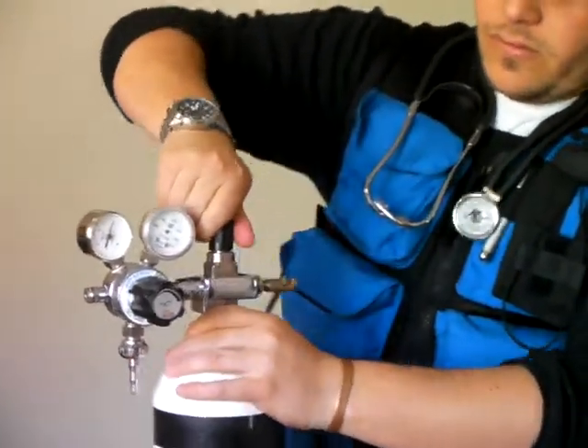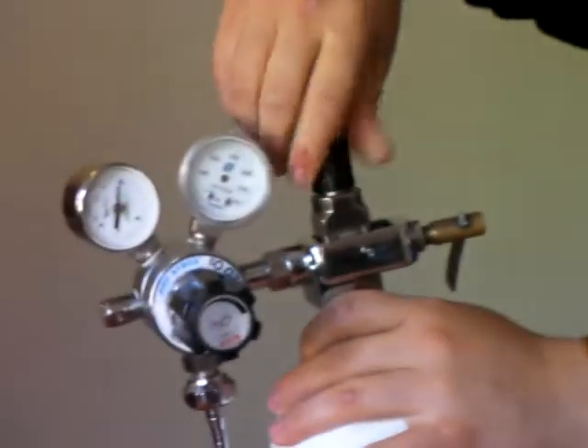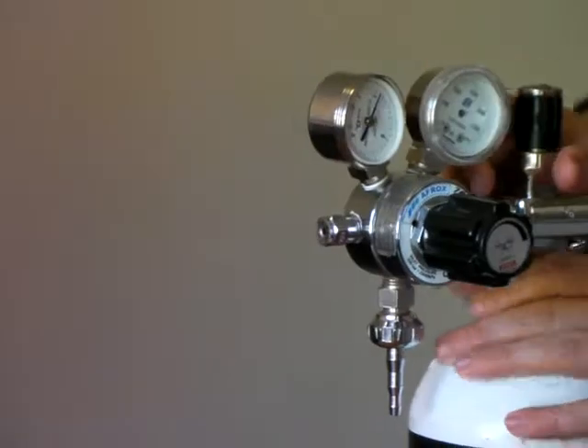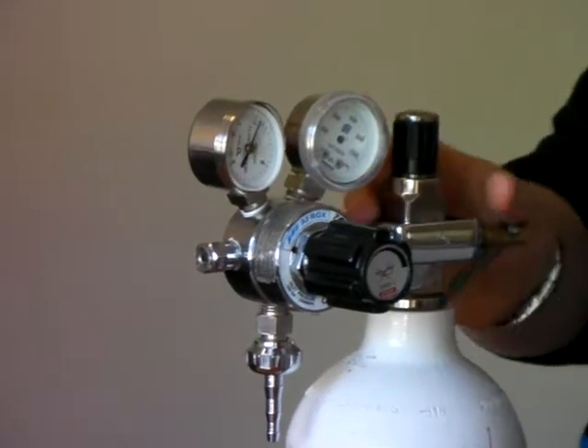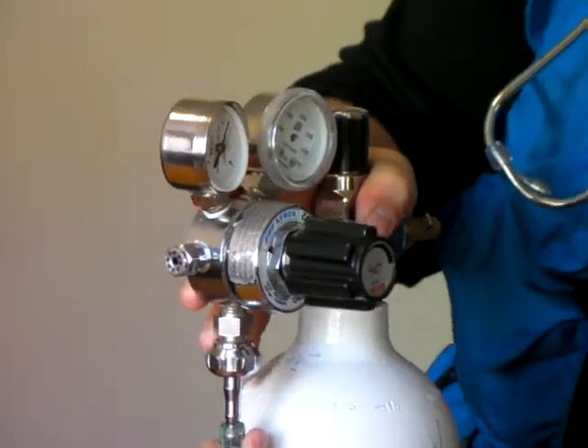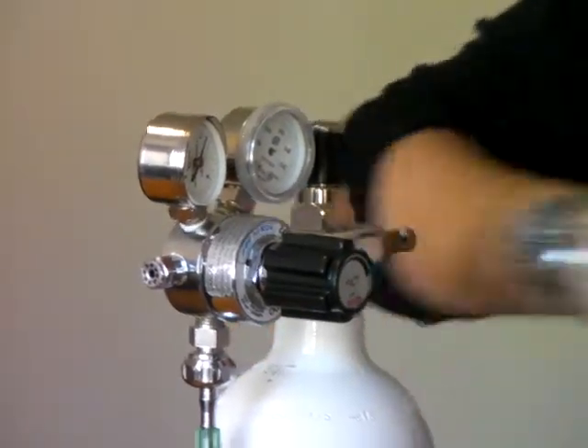Open the valve away from your face and listen for any leaks. Keep it open. Connect the tubing to the cylinder and then to the mask.